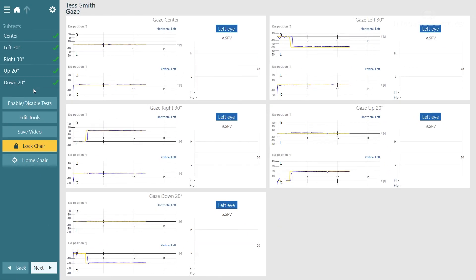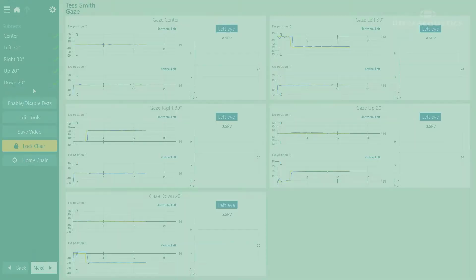What we can see is the results for all five gaze positions. And as I mentioned before if there was any nystagmus present this would be extracted and displayed in each of the average slow phase velocity graphs which can be seen to the right of each test.